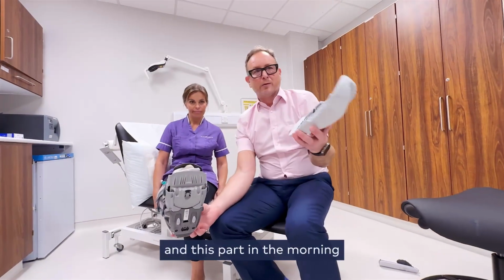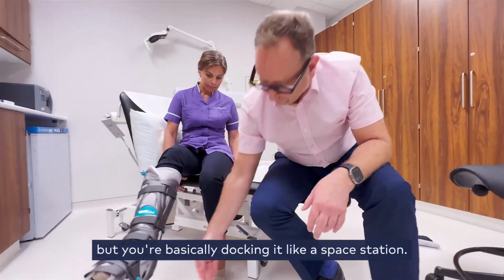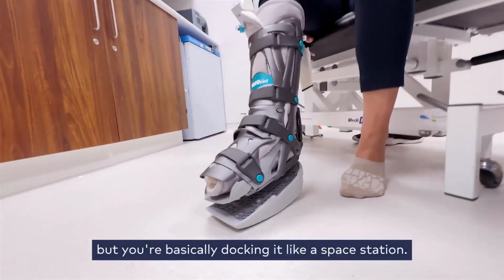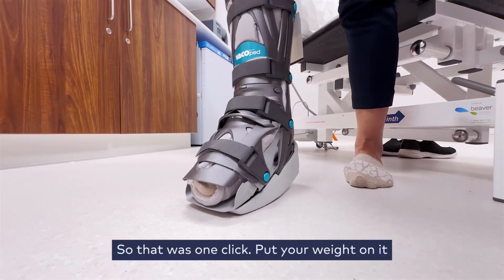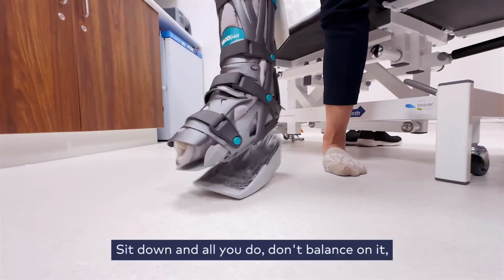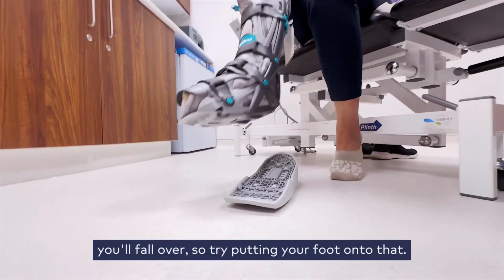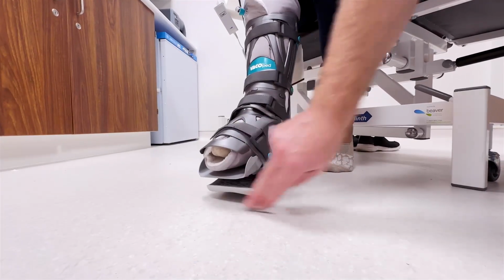And this part in the morning you try and dock it, which isn't as easy as it looks, but you're basically docking it like a space station. You're trying to fit it in there and you should hear 4 clicks. So that was 1 click. Put your weight on it and you should feel the other 3 clicks. Sit down and all you do, don't balance on it, you'll fall over. So try putting your foot onto there. It's not the easiest thing. You'll get used to this.